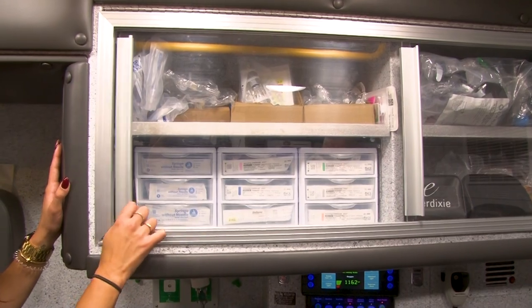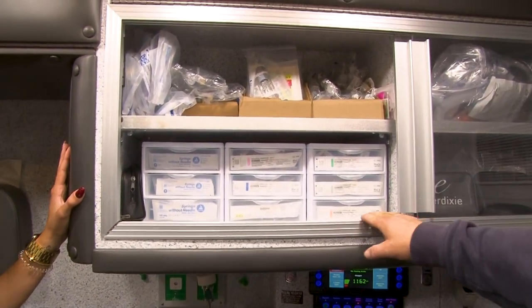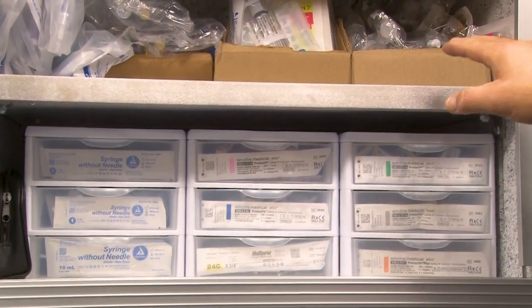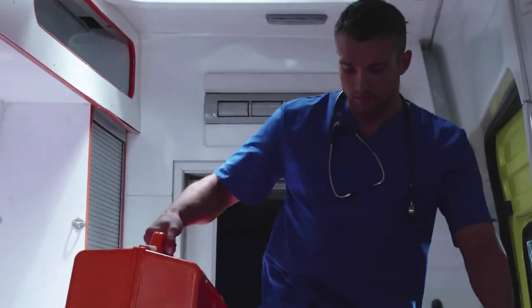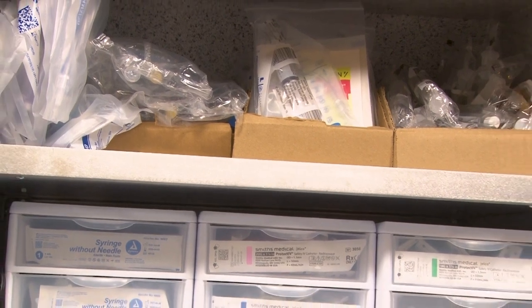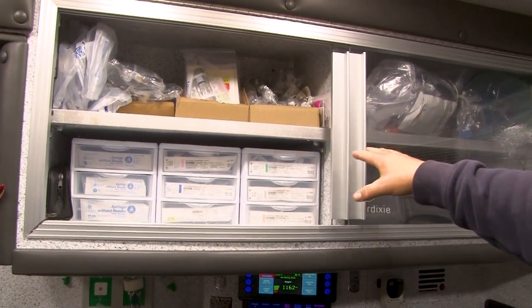So as we move along to the captain's seat of the ambulance, an EMT or paramedic will sit here, and they have access to some very vital equipment that we have. So we have some fluids, IV setups, different size needles, and some more fluid up there in that compartment that we can administer to a patient who needs it. Normally, we're going to give fluid to a patient who's hypotensive, has low blood pressure, maybe they're a little bit altered. Maybe they have a fast heart rate and we want to try to slow that down with a fluid challenge. So they have access to that all right here.